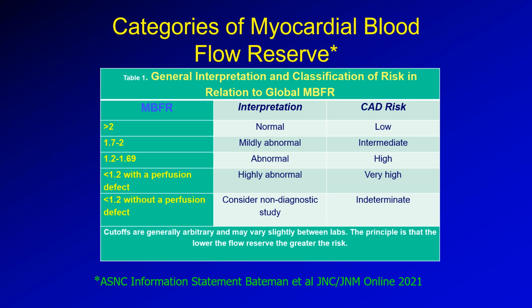And that's because they just have advanced age. A patient in their 80s may be at 1.9, 1.8, something like that, when they're perfectly normal. So it's not clear cut. It's very important to get a very good history on patients and to look at all, or the majority of, the data that's on the study.